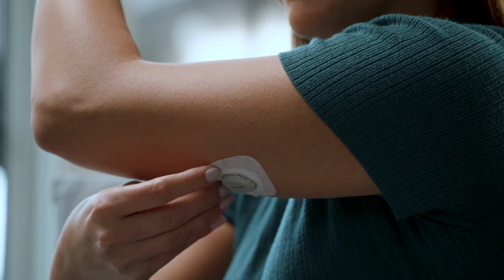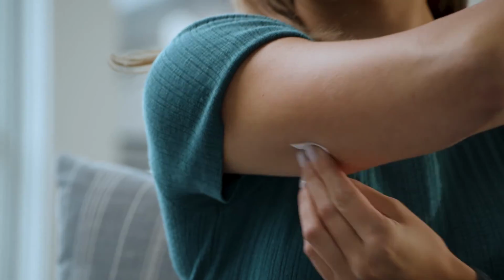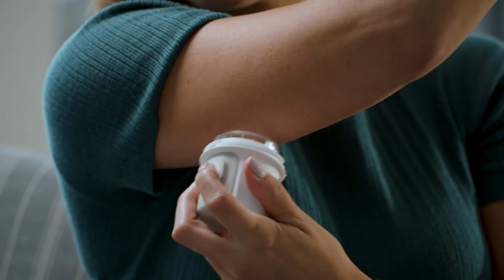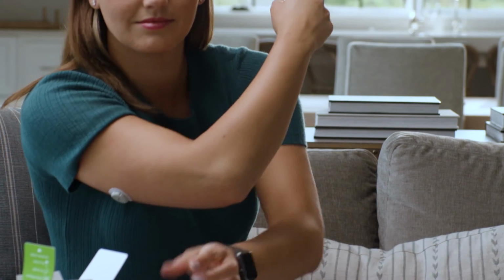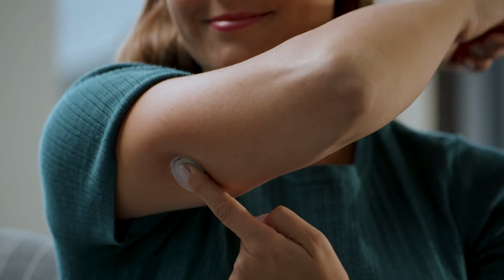To remove your sensor, peel off the patch like a bandage. Now you need to insert a new sensor. Clean your new site with an alcohol wipe. Unscrew the cap. Press and hold the applicator firmly against your skin and push the button. If you need a refresher on sensor insertion, you can review the in-app instructions.